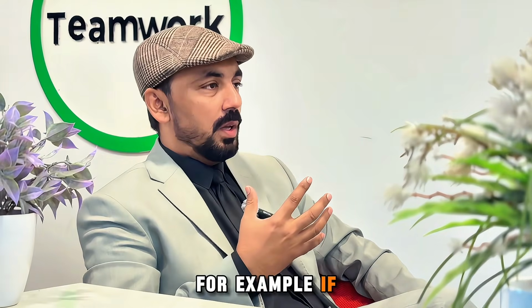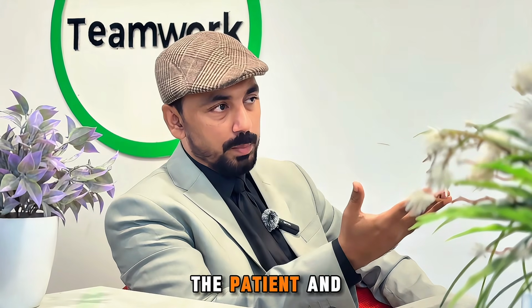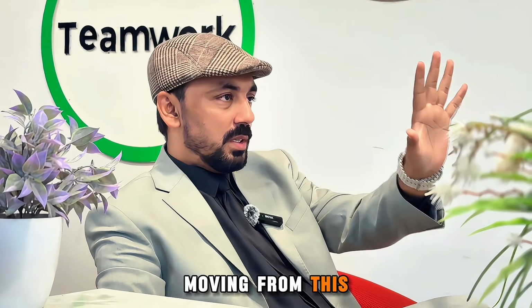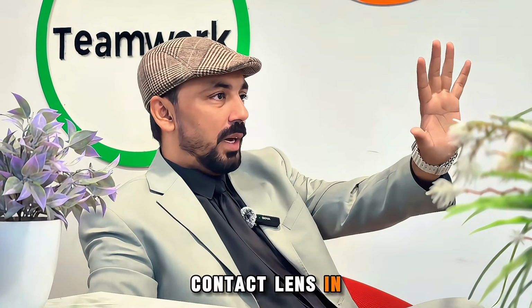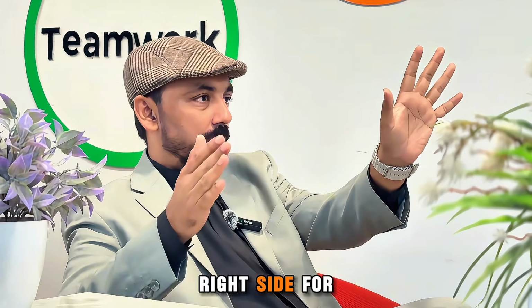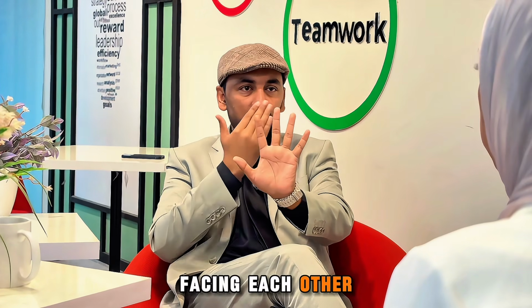For example, if I'm a contact lens practitioner and you are the patient, and this is a contact lens, and it is moving from the 6 o'clock position towards this side, this is my left side. And if the contact lens in the patient's eye is moving towards this side, this is my right side. We are facing each other, right?